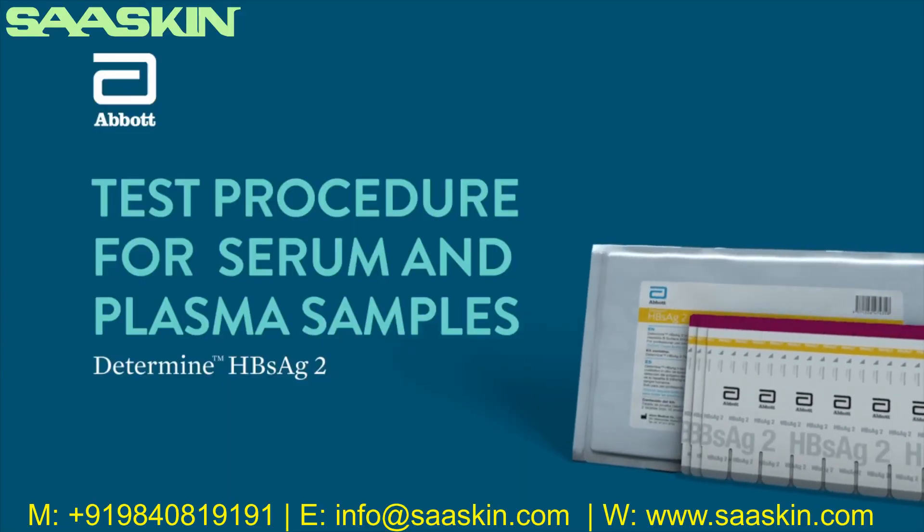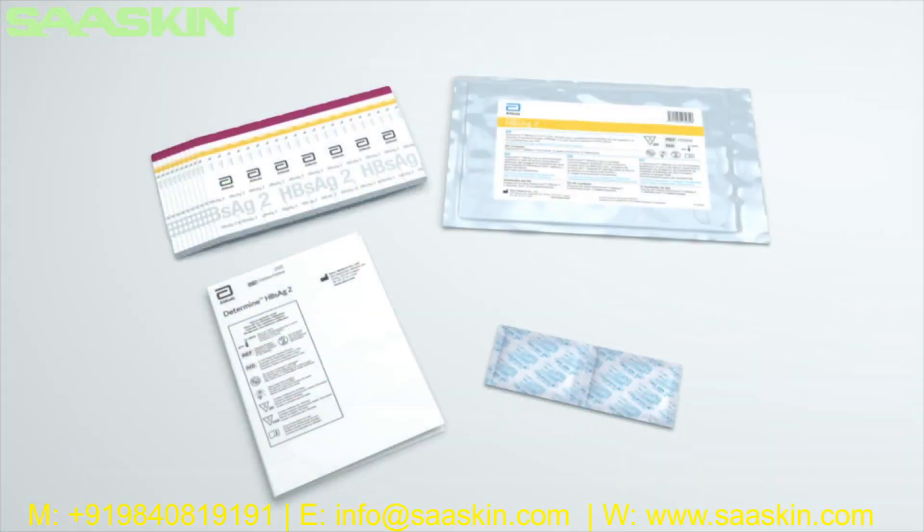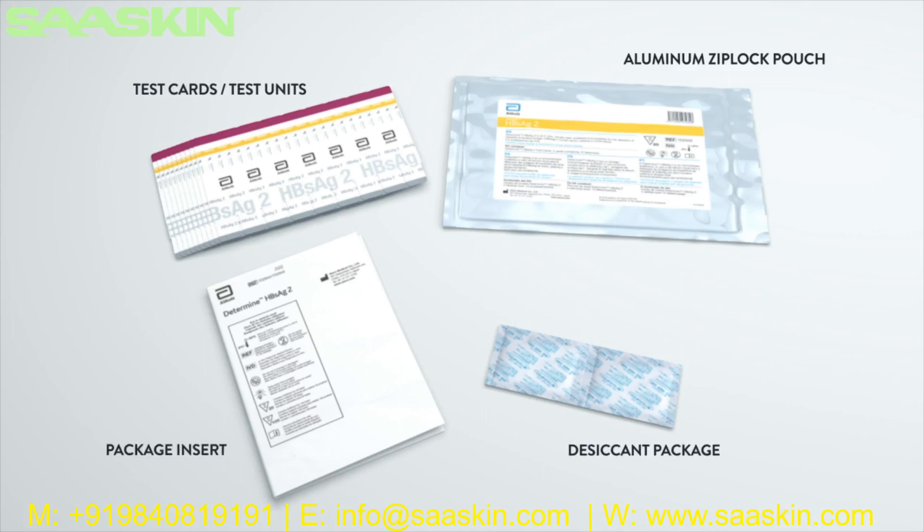The Determine HBsAg2 test procedure training for serum and plasma samples. The Determine HBsAg2 test is a visually read qualitative immunoassay for the detection of hepatitis B surface antigen (HBsAg) in human serum, plasma, or whole blood. Each hepatitis B surface antigen kit contains one aluminum Ziploc pouch containing either 20 or 100 tests, a desiccant package, and package insert.